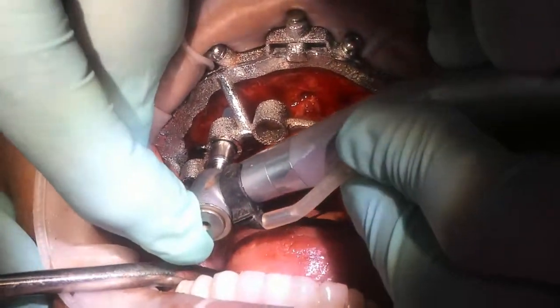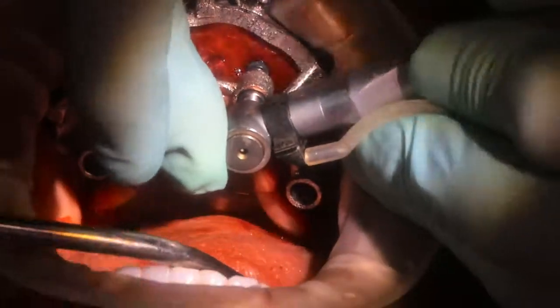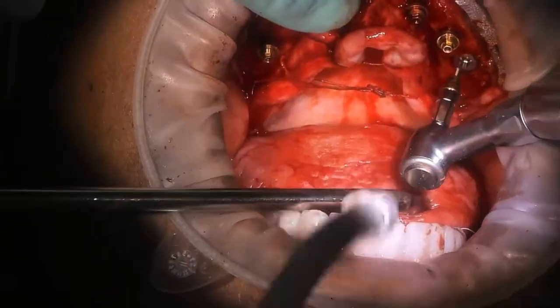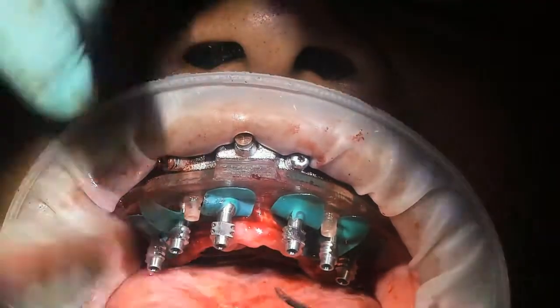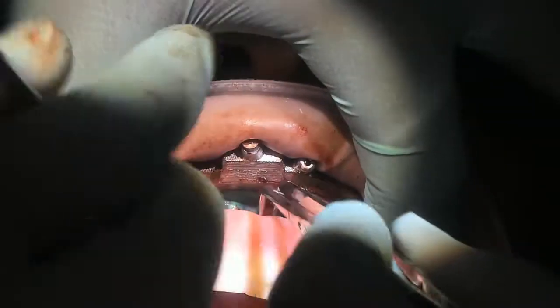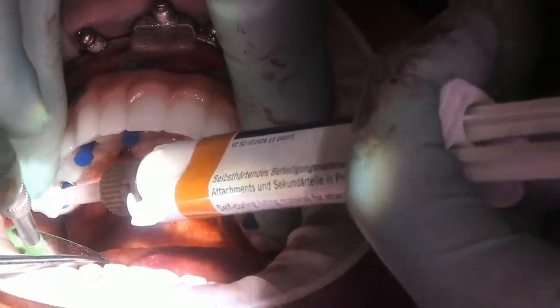The implants are placed, and just like many systems, this system allows the implants to be placed through the surgical guide. Once the implants have been placed, the carrier guide is reinserted and the abutments are placed along with the temporary cylinders. In this case, the doctor used impression posts. They are all tightened down and the green gaskets are used to block out the carrier guide. Once the prosthetic is fully seated under the carrier guide with no rock or gap, adjust as needed, then the small blue block-out plugs are placed in each cylinder.